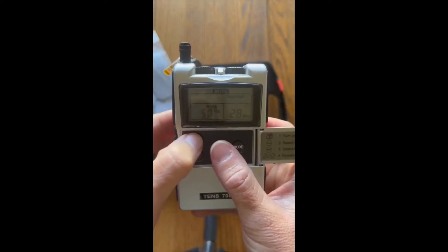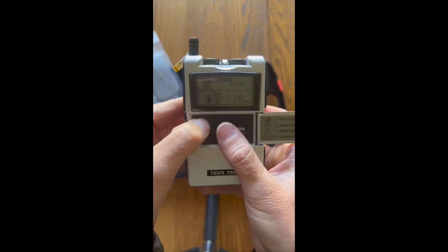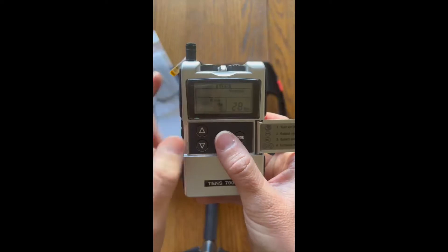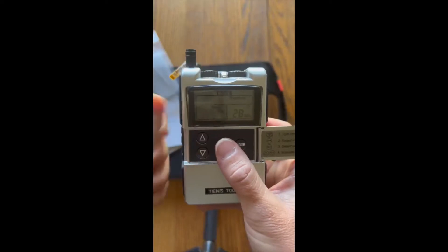For general pelvic floor strengthening, if you're one of the few individuals that actually has a low tone pelvic floor, 50 hertz is best. For pelvic pain including chronic pain due to prostatitis, anywhere between 75 and 100 hertz is our ideal target.